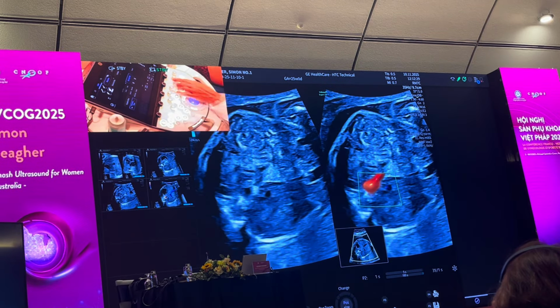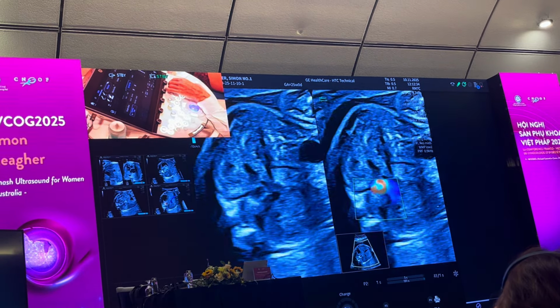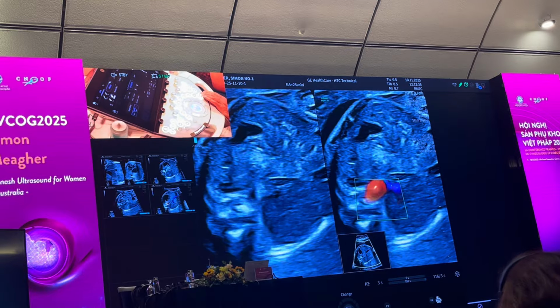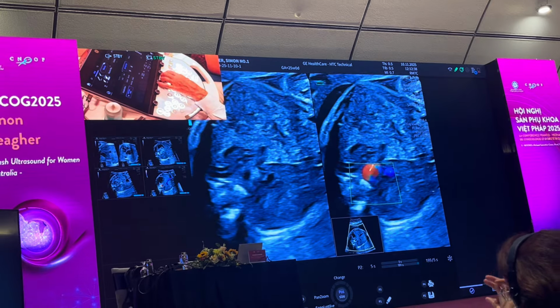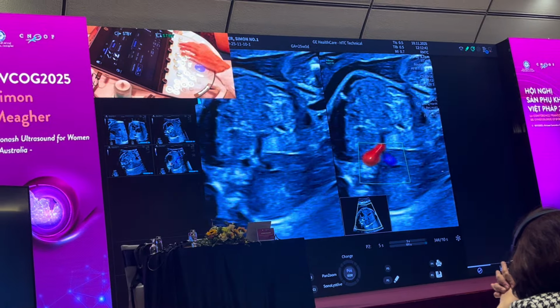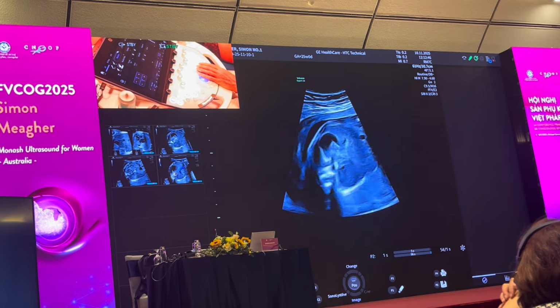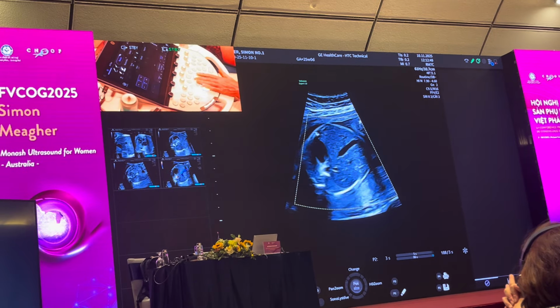If I want to bring in the IVC, I need to drop my PRF, and now I can see the IVC filling. I can see that the aorta to the left is fine, and the IVC is to the right. So this is a normal relationship between the aorta and the IVC. If I take off my color, I then go to the intrahepatic vein in a magnified image.